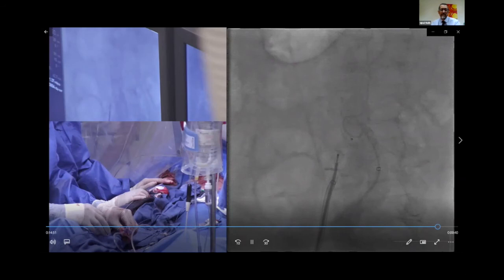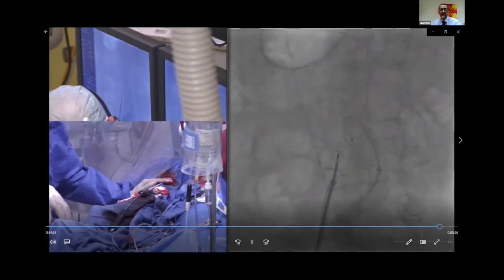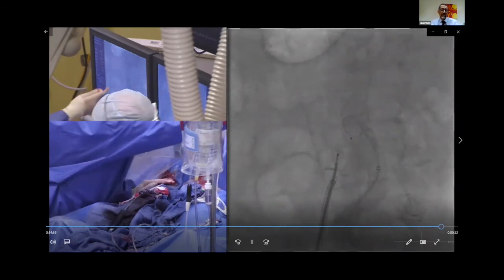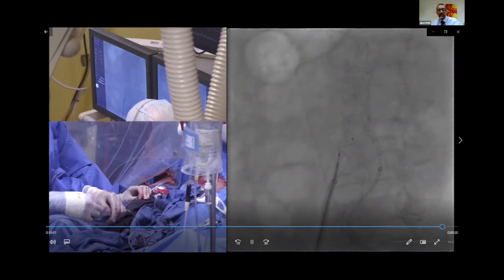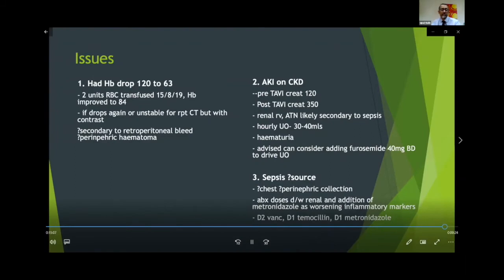So in the case here, we've got to the finish line where we've put an ADO 8mm occluder in. We used an Agilis sheath to direct it so that it was pointing at a nice angle while we deployed it. And then we've checked with an angiogram to say that we've got a pretty good seal and a flat. So he wasn't out of the woods because he then dropped his hemoglobin. And we, of course, thought he'd had a major retroperitoneal bleed because we'd done something incorrect.